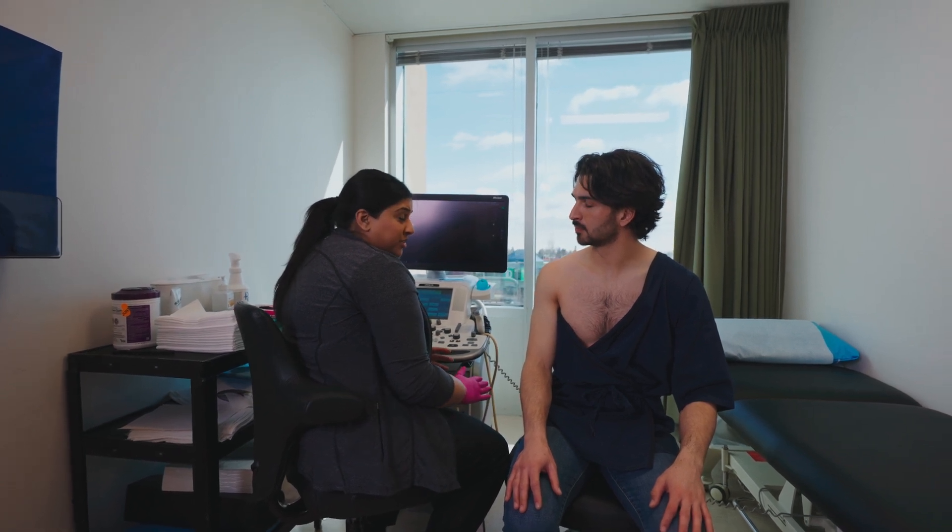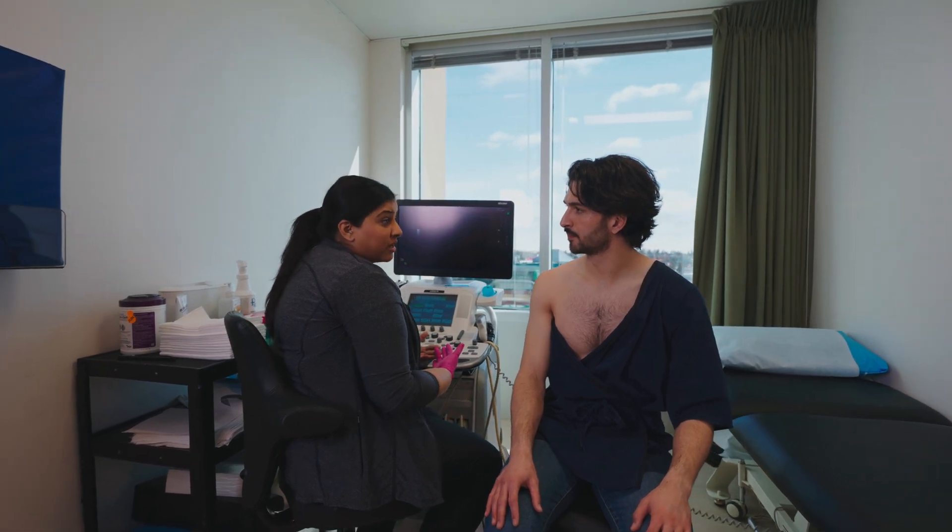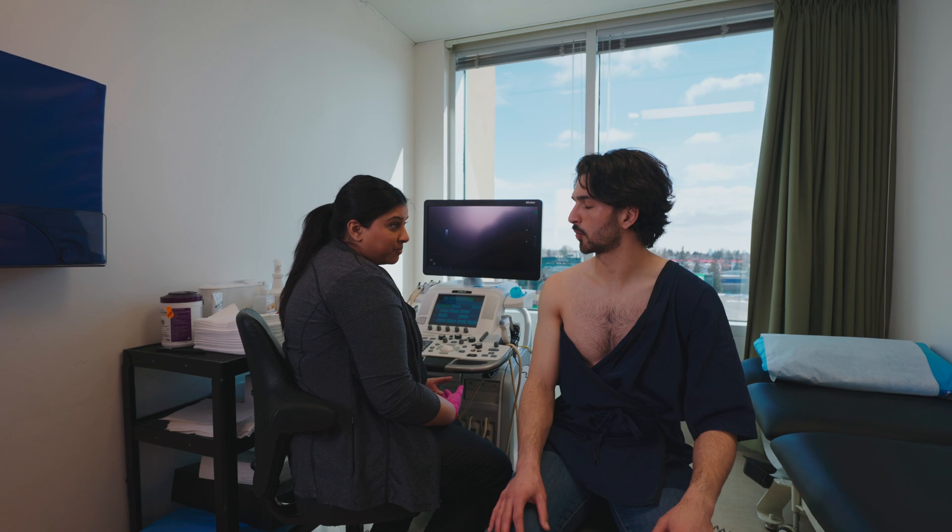What we do with the ultrasound is we look at your rotator cuff — so that's the tendons of your shoulder. I will be moving you into a few different positions today, and what that does is it just helps me see the tendons a little bit better. If anything's too uncomfortable or you need a break, just let me know. Okay, sounds good.